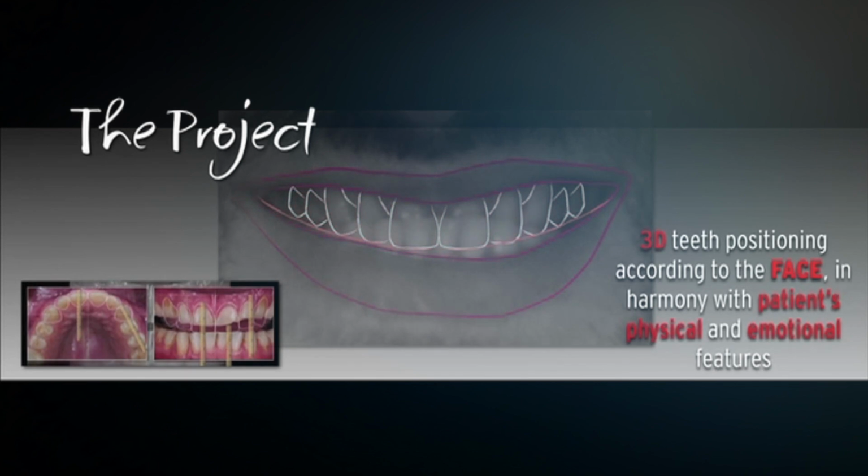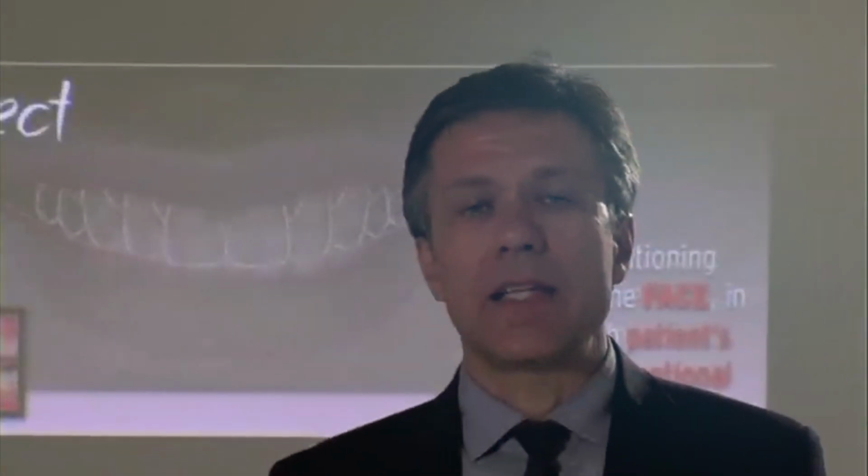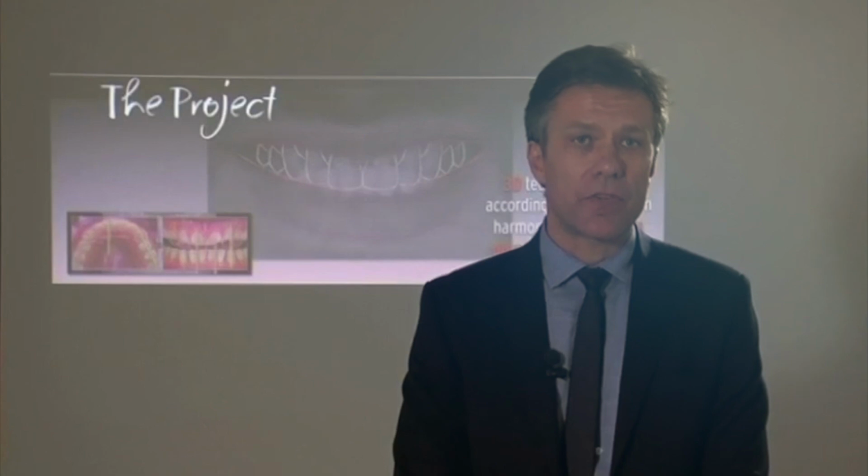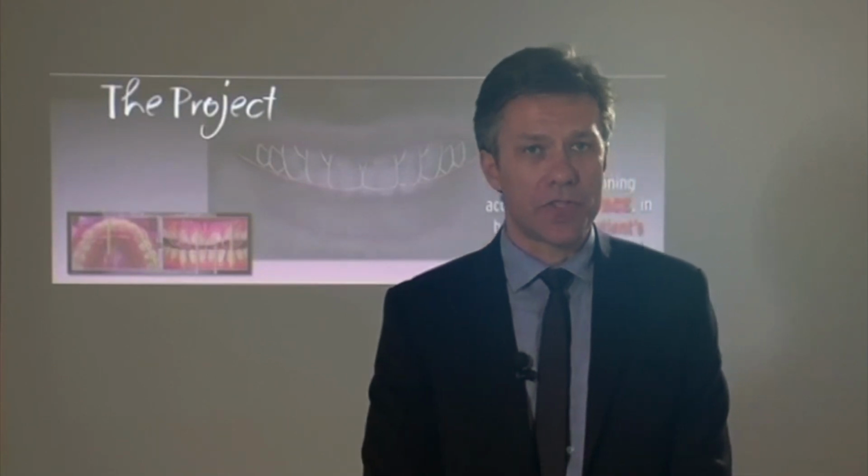Of course, it must be tested. I just did it on the computer, like a two-dimensional representation of my future wax-up. It will guide the dental technician to do a 3D wax-up, and this 3D wax-up will be tested in the mouth. It will be tested for function, for phonetics, and for aesthetics.